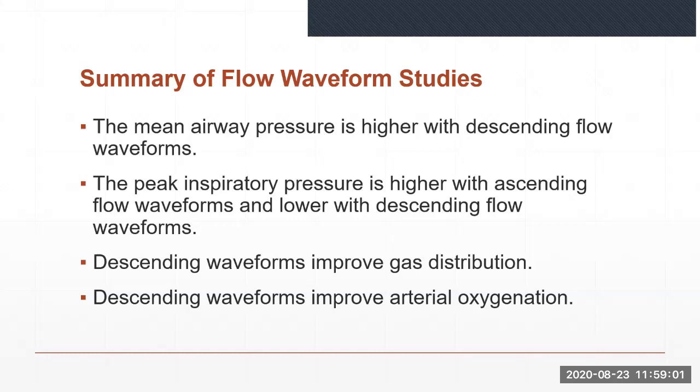There are concerns of high peak inspiratory pressure when selecting a particular waveform. When airway resistance and flows are high, peak pressures will be high if an ascending flow pattern is used. Much of this pressure is dissipated in overcoming the airway resistance and may not reach the alveolar level. Thus, high peak pressures do not always increase the risk of damage to the lungs.